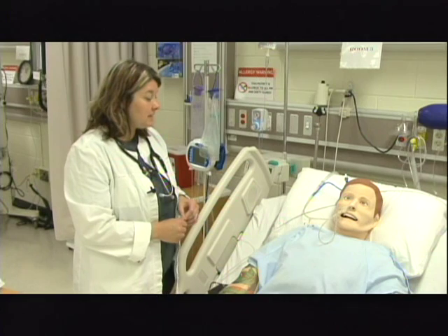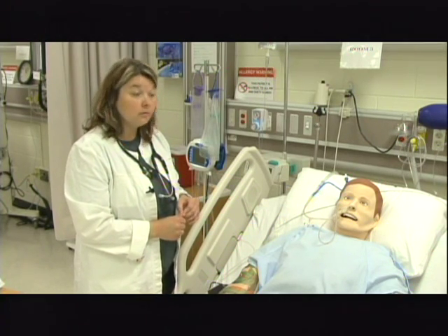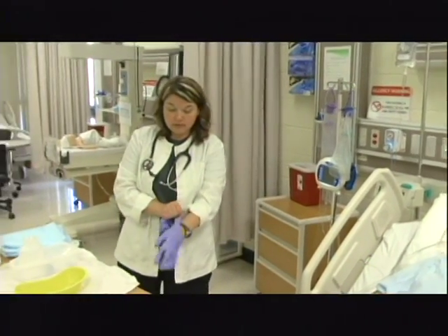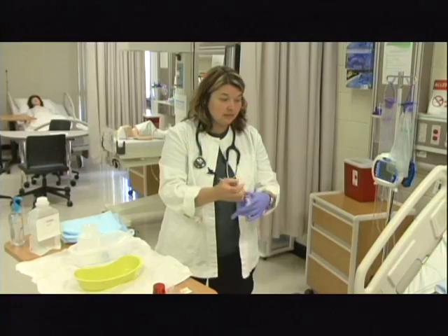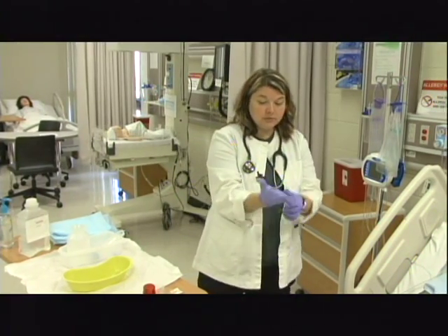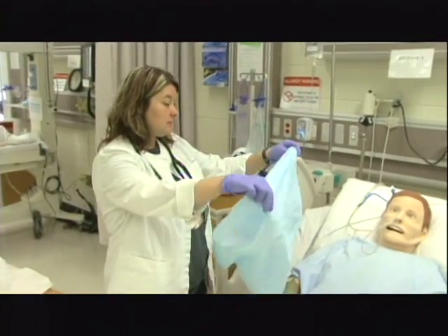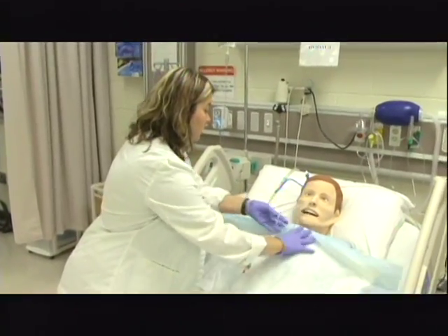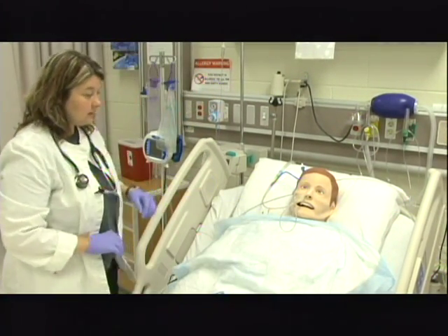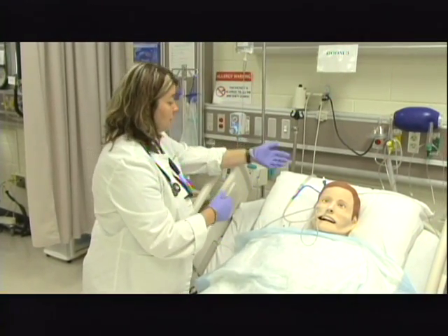I need to ask him if he has any further questions or if he has any needs. He says that he's okay, so I'm going to move on with the procedure. I'm going to come and grab my gloves here first, and I'm going to go ahead and put these on, again, because I'm going to be manipulating the tube, and I could be exposed to gastric secretions. I'm going to grab my waterproof pad, and I'm going to go ahead and place this on Mr. Smith so that I don't end up getting any gastric secretions on his bedding or any of that kind of stuff too. The very first thing I need to do is go ahead and turn off the suction.